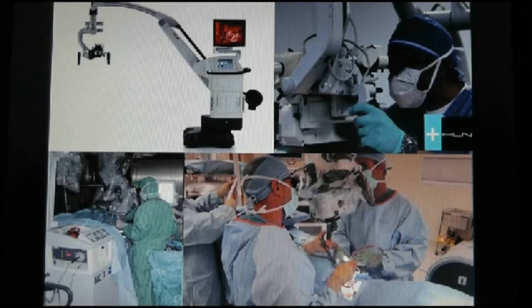The surgeon's looking straight into it like he's in a submarine. But the image goes down onto the patient, and here is what it looks like. The microscope is draped over the patient, and it's all covered with plastic, so it's sterile. Here's the surgeon, here's the assistant, and you're facing each other, but you're looking down into the patient, operating down. This way, the assistant has the same view as the surgeon, so it's great visualization.